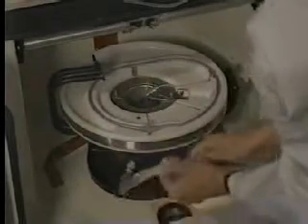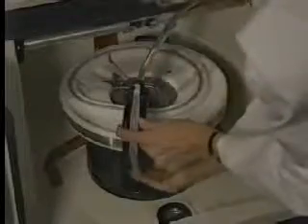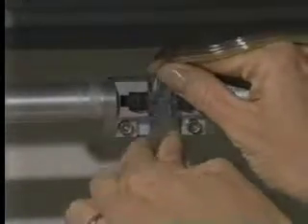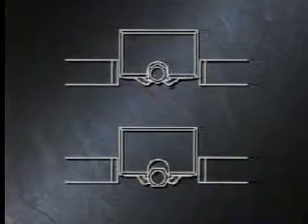Check the bearings to be sure they are securely attached to the tubing. Place the lower and upper bearings in the appropriate bearing holders. Make sure the bearings are seated properly. Place the upper collar in the upper collar holder. After placing the collar into the holder, visually check that it is installed properly as shown by this diagram.